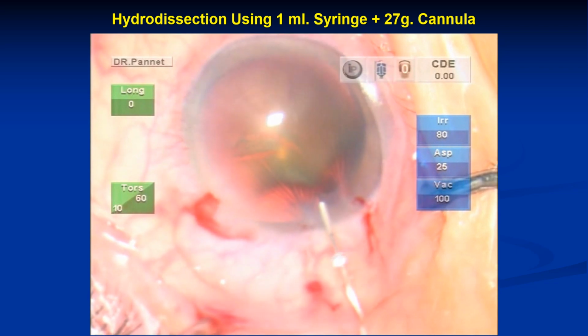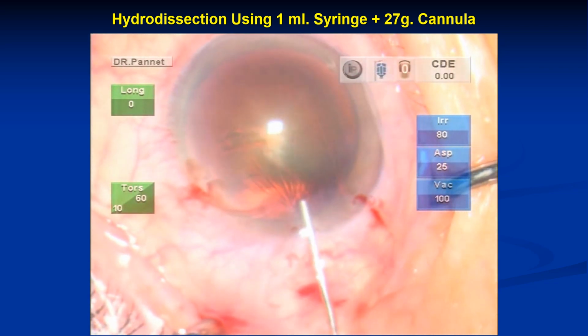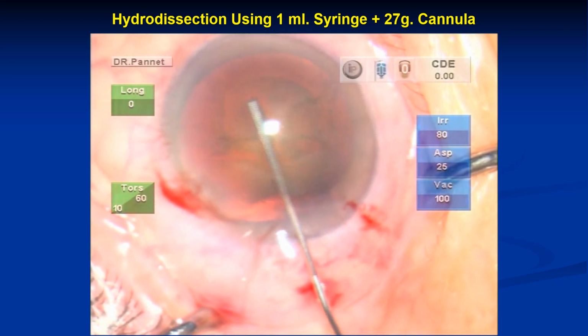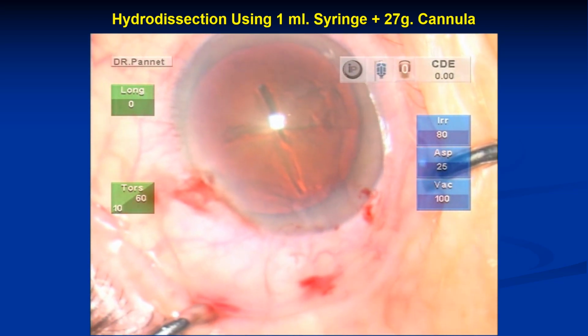Press the posterior lip to release some viscoelastics. Then inject fluid under the capsulorhexis margin, using short pulses with high force. Repeat the injection pulse until the fluid wave and nuclear lifting sign are observed, then push the nucleus downward to release the fluid.